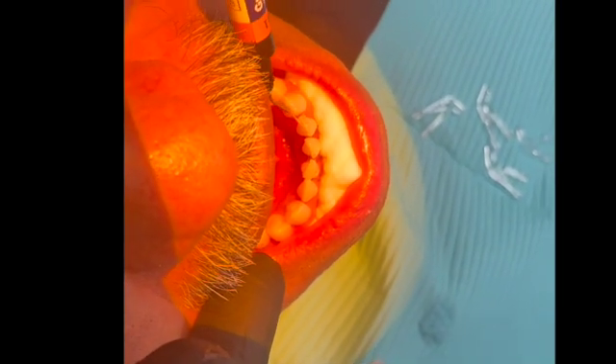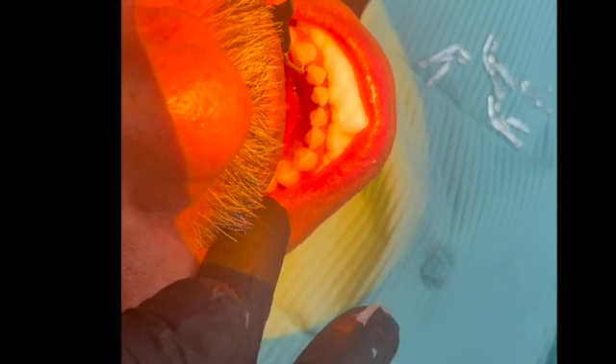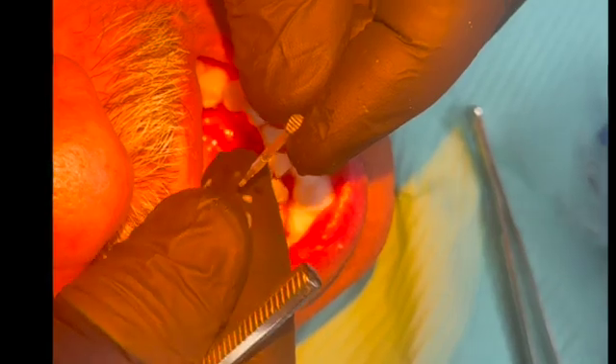Then I'm going to put a little dot on each tooth, and using cotton pliers we'll set the ribbon on the inside of each tooth. We have these little clips that we can use to hold the ribbon in place. He's got some gaps between his teeth so we won't be able to use the clips on every contact, but we can use them on a couple to hold it in place.